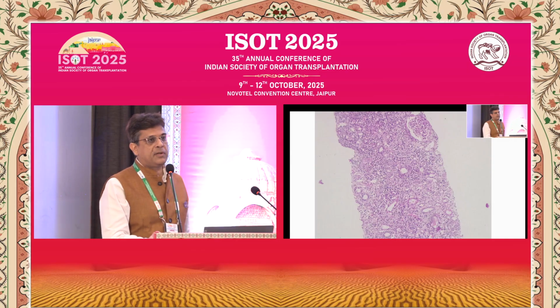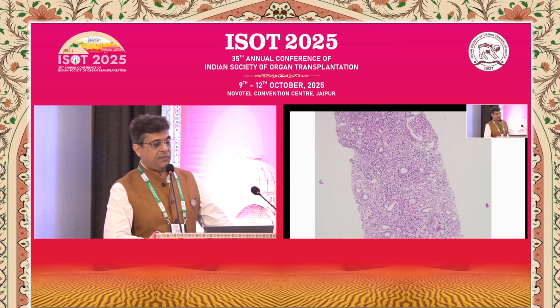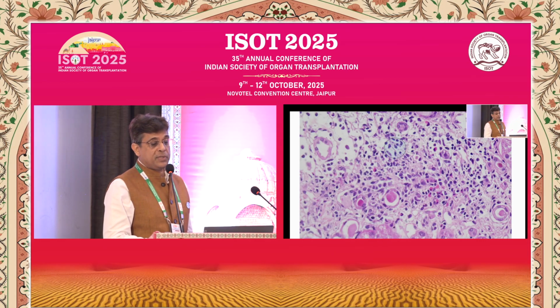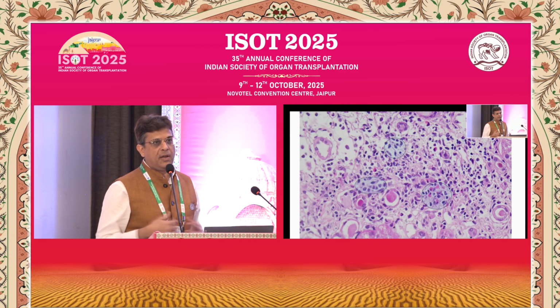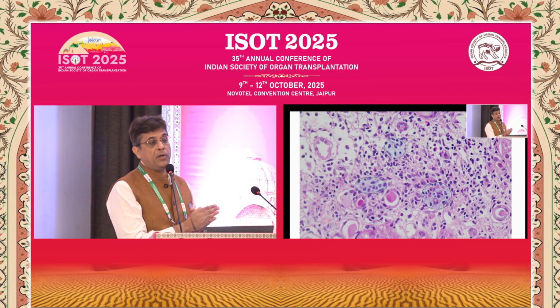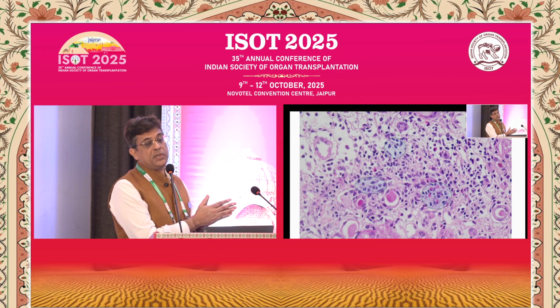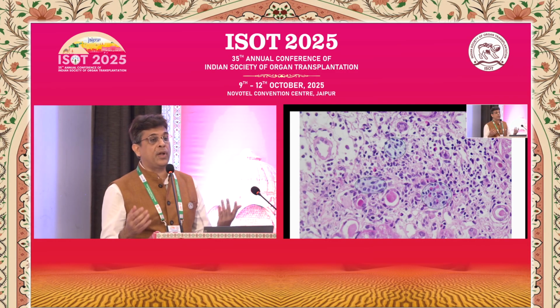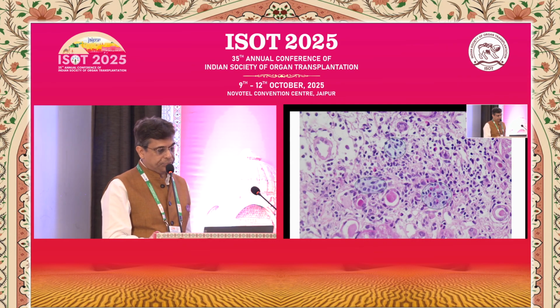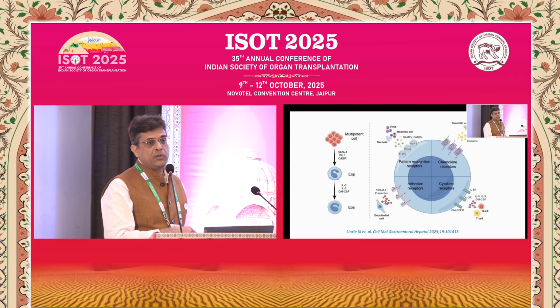So an inflamed graft is always a cause of concern. And as we go down, we try to see what kind of cells there are. These could be lymphocytes, eosinophils, or plasma cells. Most of these cells, as I said, occur together, and it's up to us to look at the biopsy diligently and figure out which one is the dominant one and what the clinical scenario is in which this inflammation is occurring, and then make an appropriate diagnosis, whether it's a rejection or something happening as part of a reactionary process, and so forth. Now we'll start with eosinophil.